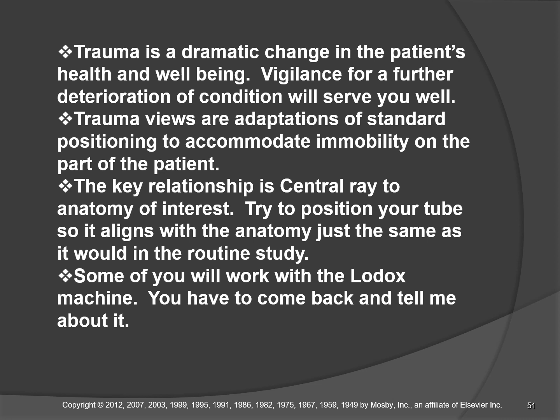Central ray is directed to open up the anatomy and display it with minimal superimposition for each and every view. And so you need to preserve that, otherwise you start closing off joint spaces and elongating or foreshortening certain features of the anatomy. Try to position the tube so it aligns with the anatomy just the same as it would in a routine study.